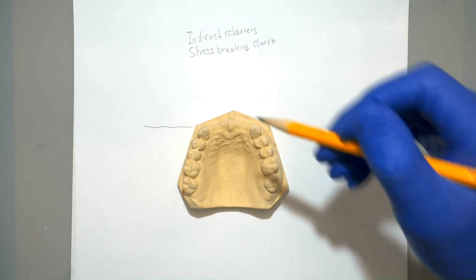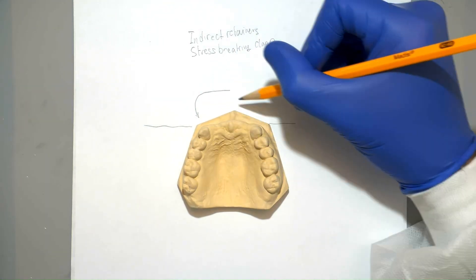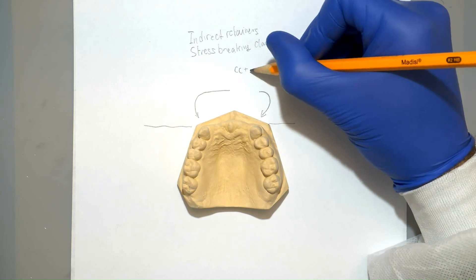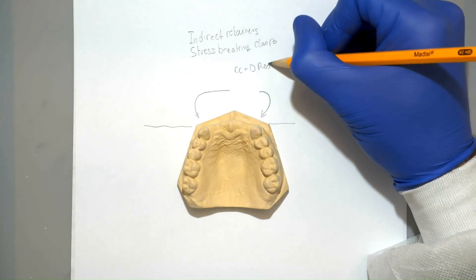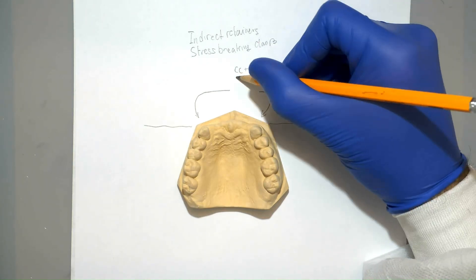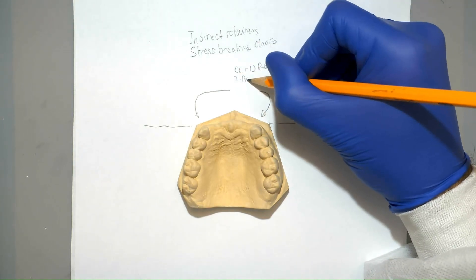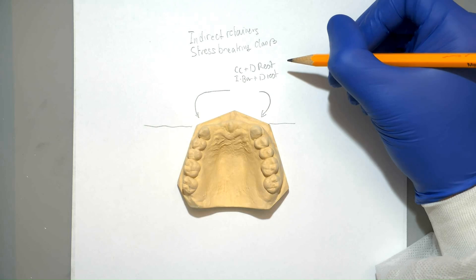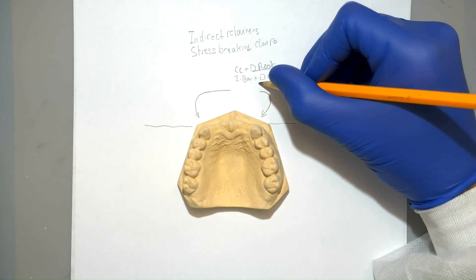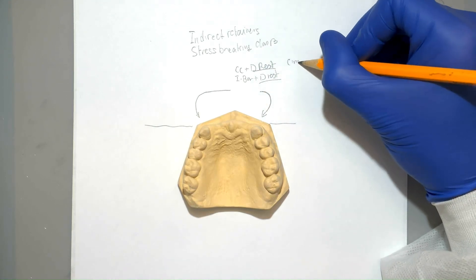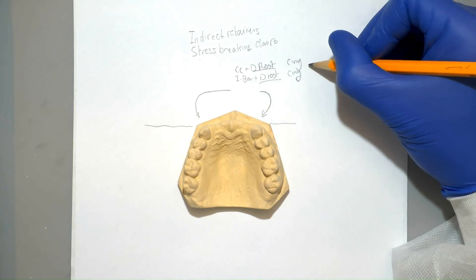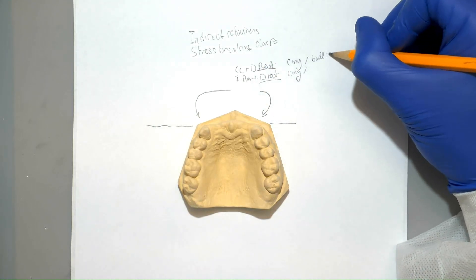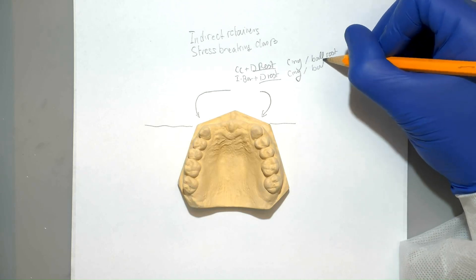Stress-breaking clasps are going to be a little different. On these two teeth, we're going to be talking about cast circumferential clasps with a distal rest and an I-bar with a distal rest. In those cases, those are anterior teeth, so we're going to be using a cingulum rest or a ball rest.